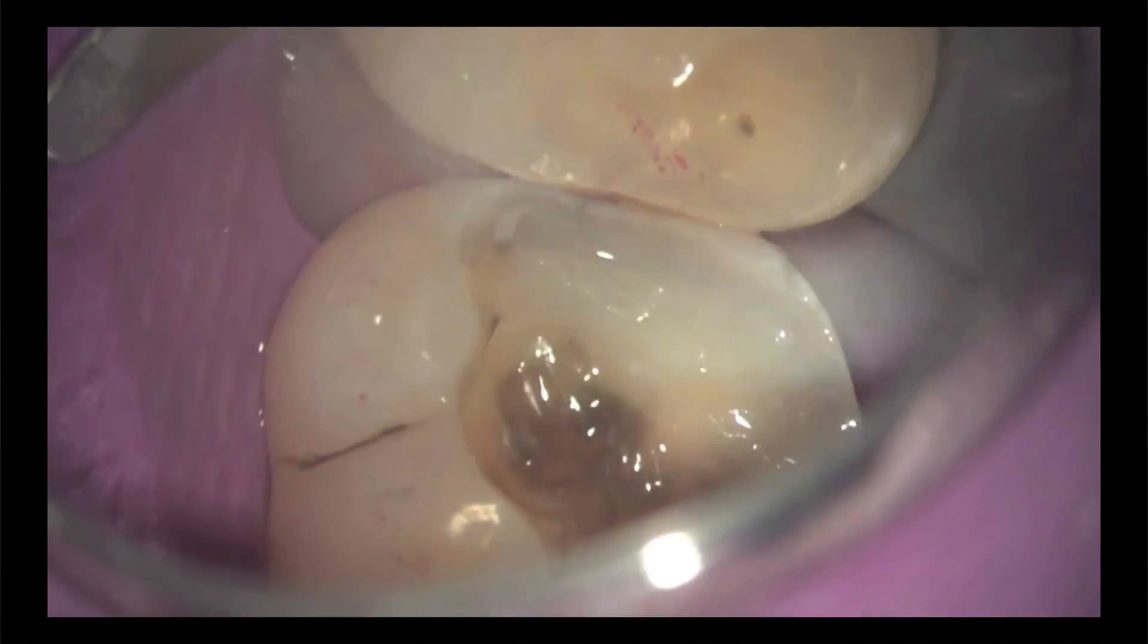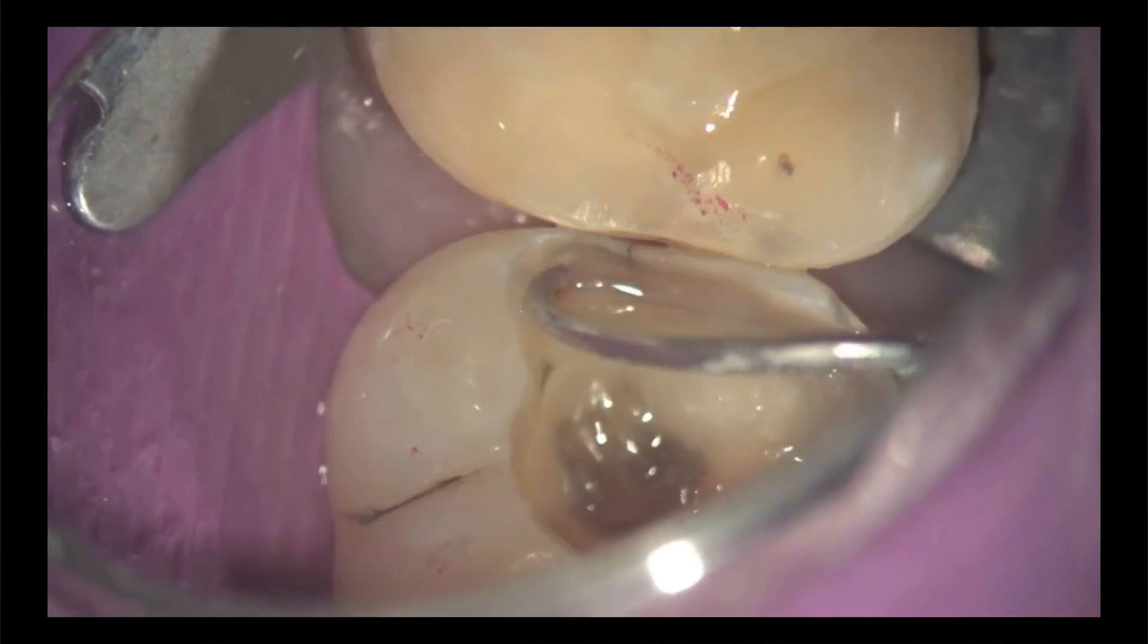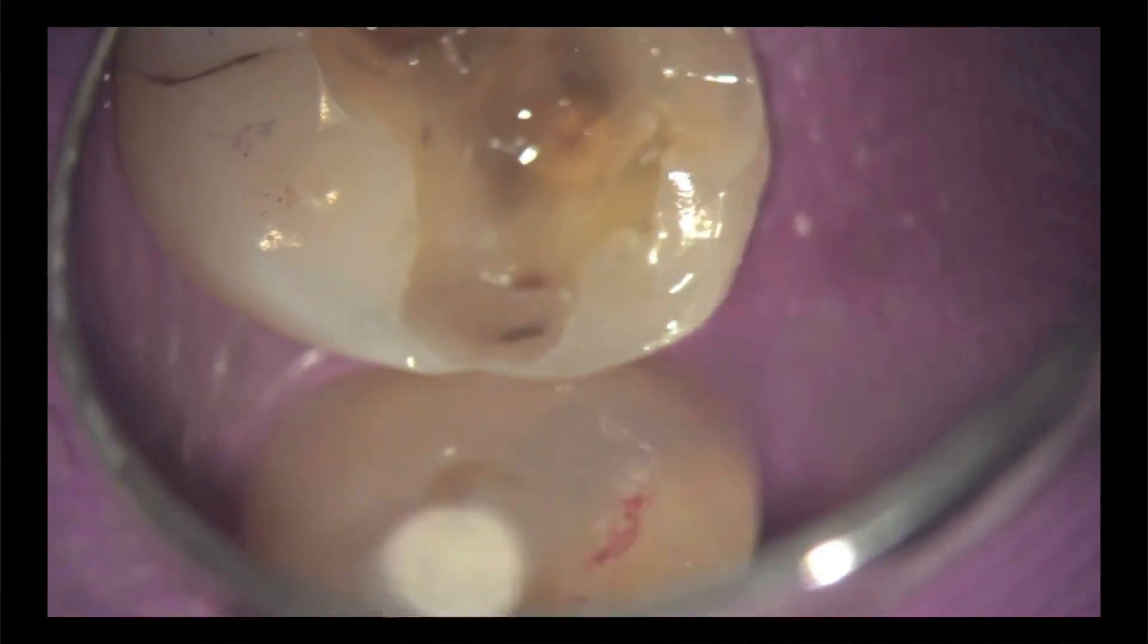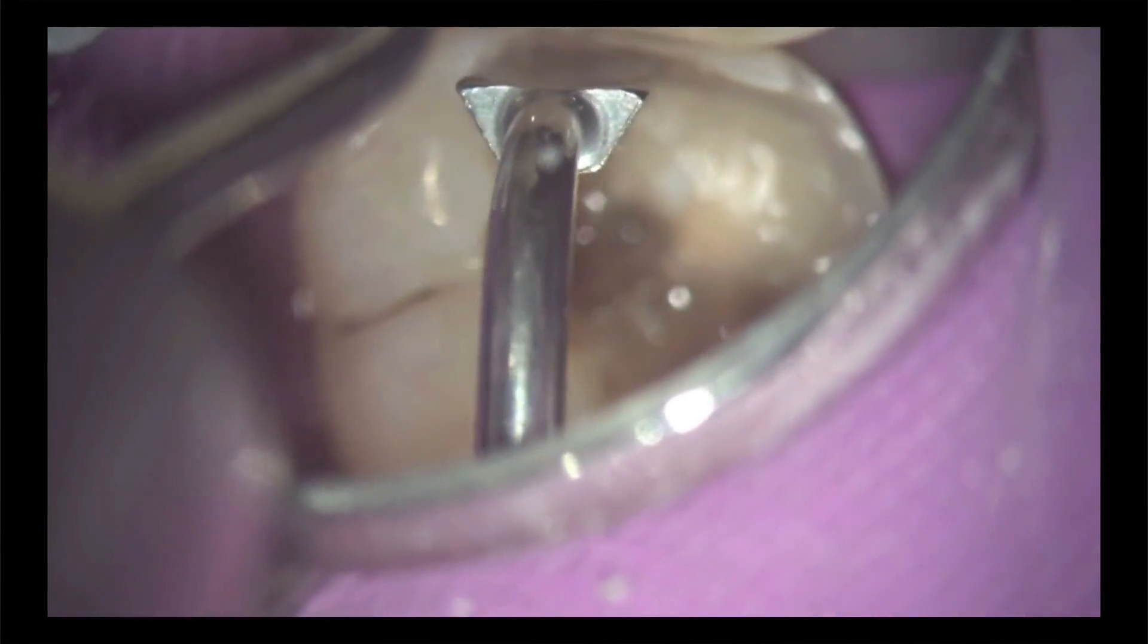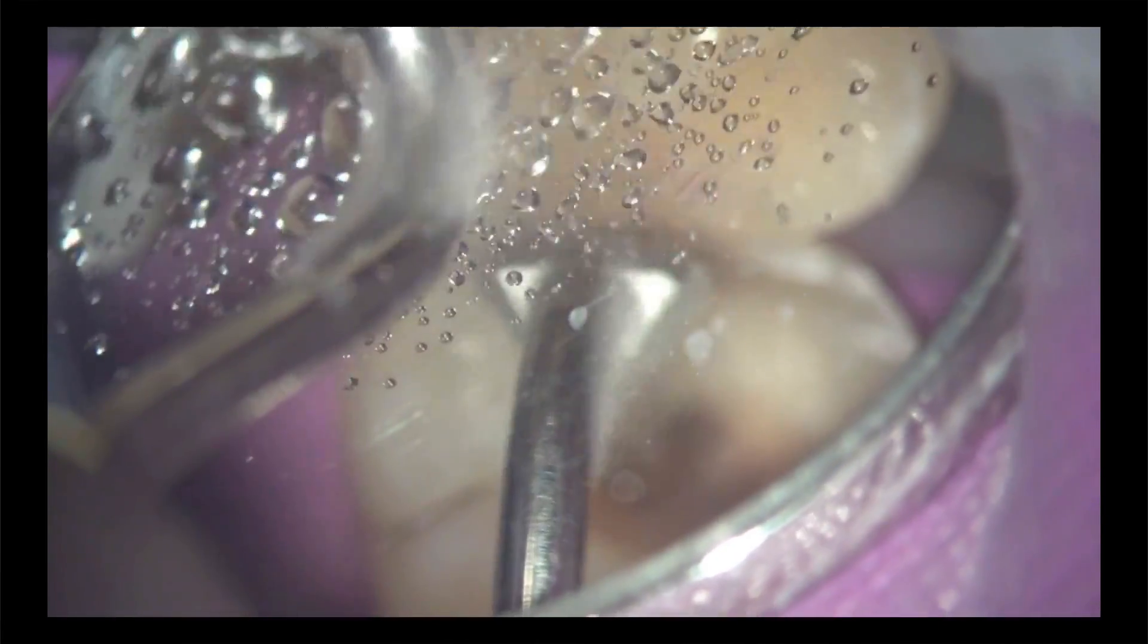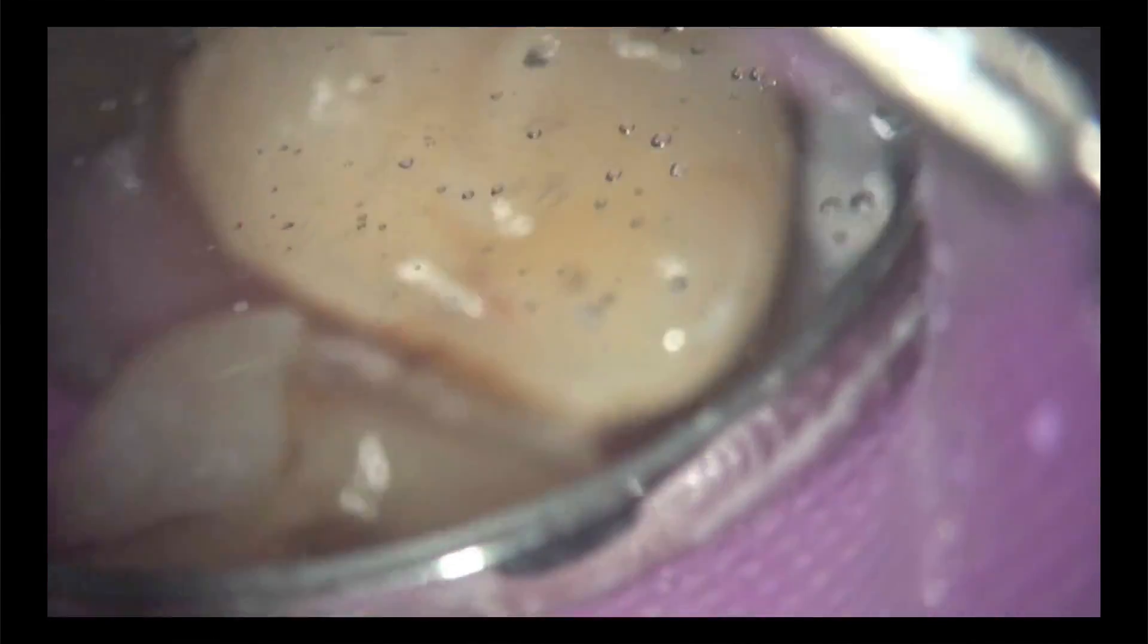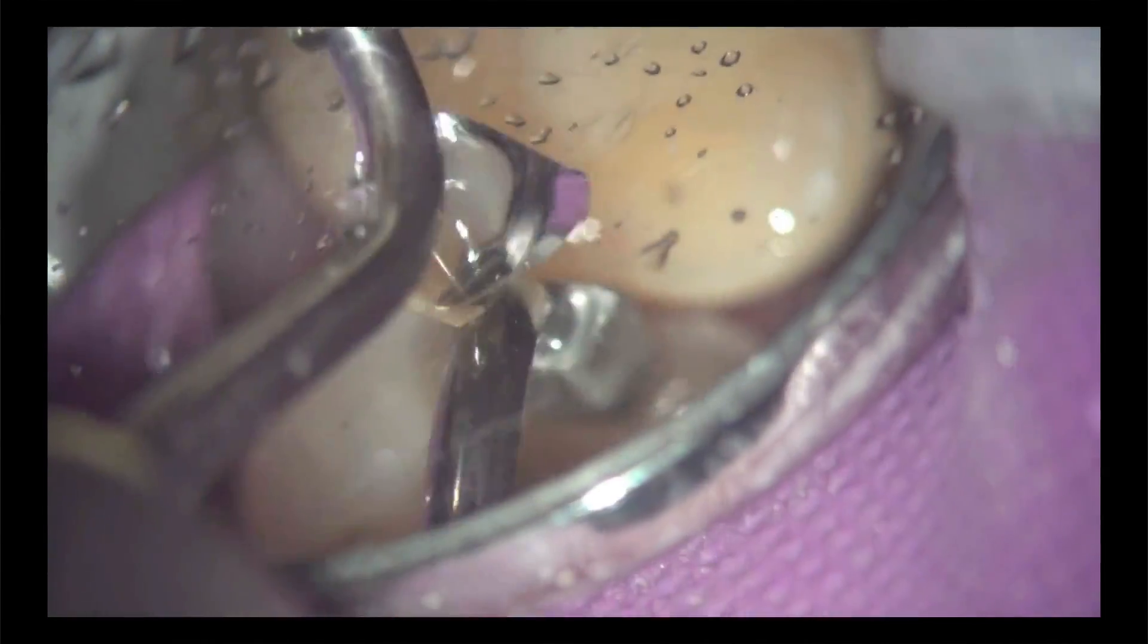So if you look here, here's the distal. You can see it needs further preparation. There's a fracture line and there is some caries and some enamel that needs to be cleaned up. Here's the mesial. You can see there's mesial caries. The adjacent tooth does not need to be prepared on the distal. So here's the sonic instrument going in place. You can see the flat surface again. Adjacent teeth next to this prepared tooth do not need any kind of preparation. So we want to use this to get rid of that caries and to extend our box form so that the enamel of the box of the onlay, of the wall of the onlay, is not decayed. And there's a little bit of decay there.